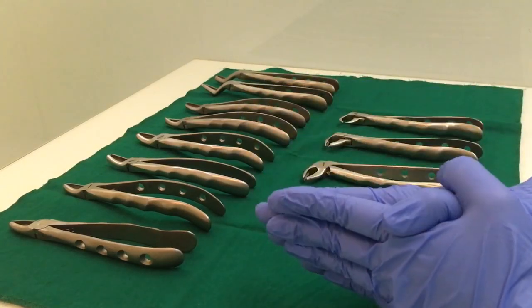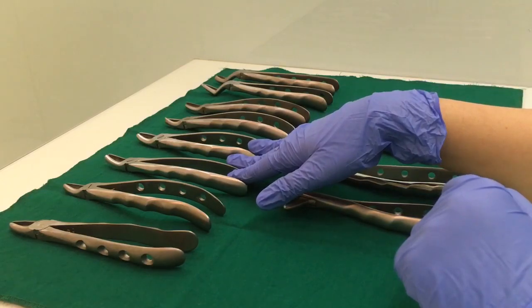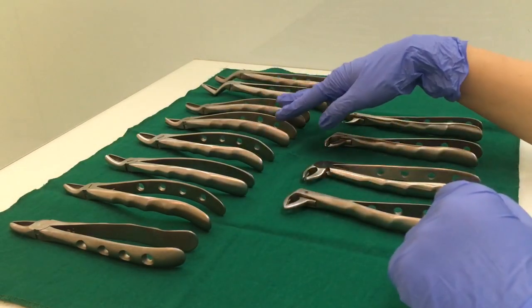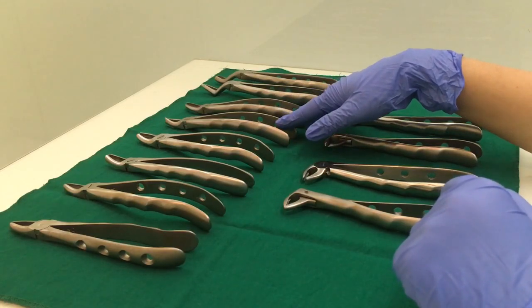So we have learned about the upper anterior, upper premolar, a set of upper molar forceps which has one pointed end, and a set of upper cowhorn forceps which has one pointed and one bifid end.